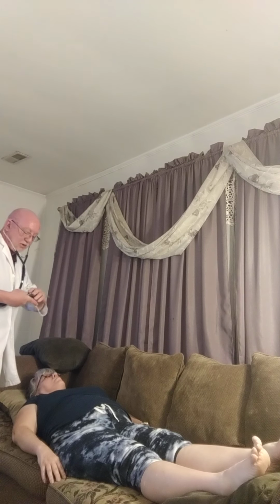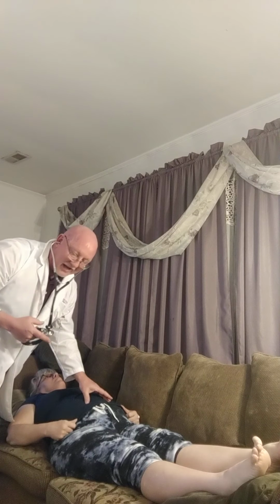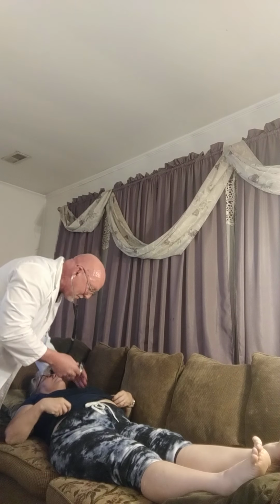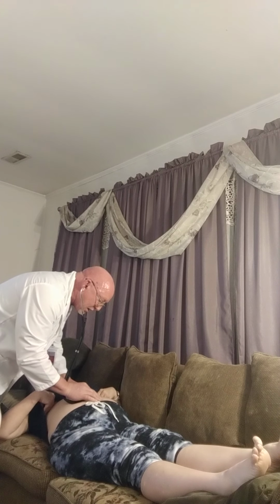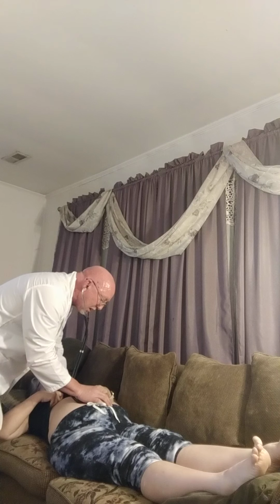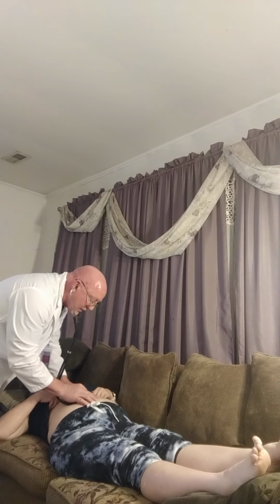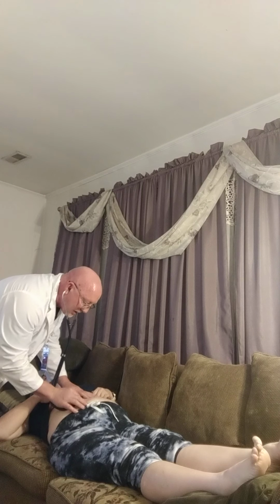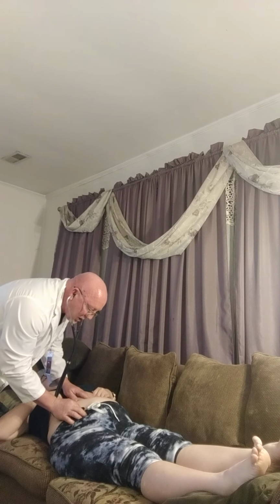All right, we're going to do the same thing with the abdominal aorta, iliacs, renals, and then the femoral. Bring that up, a couple inches above. And we'll go out.